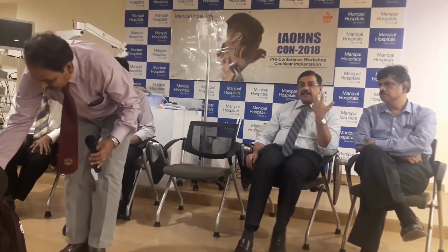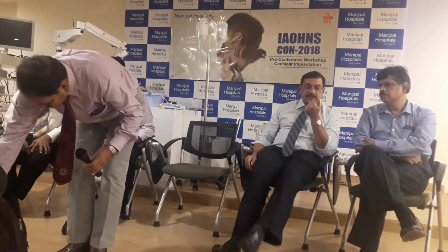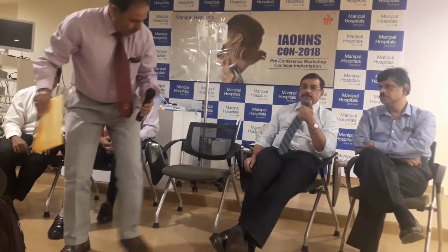So what are the common stimulations outside the cochlea? One is the tympanic plexus. That nerve can get stimulated and patients can have deep-seated pain. That's one symptom that they complain about. The second thing that can happen is facial nerve stimulation, causing facial nerve twitching.